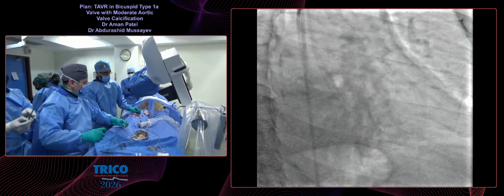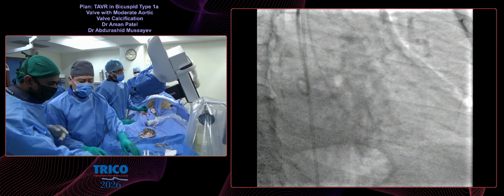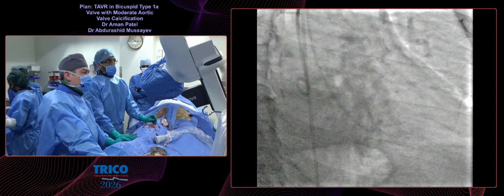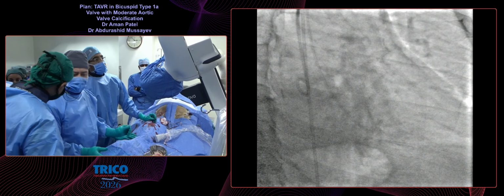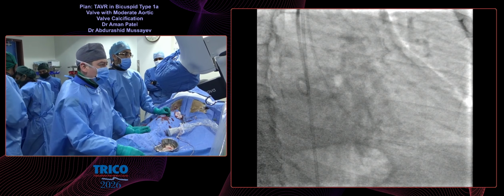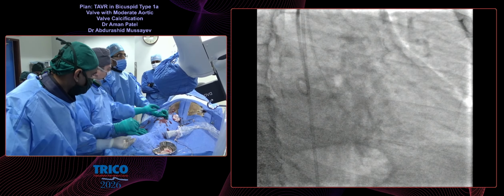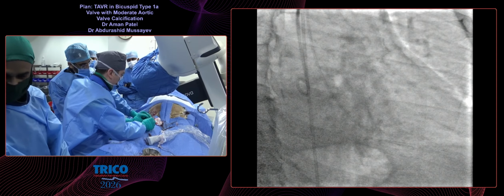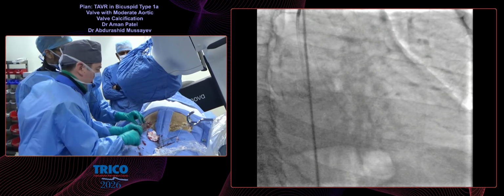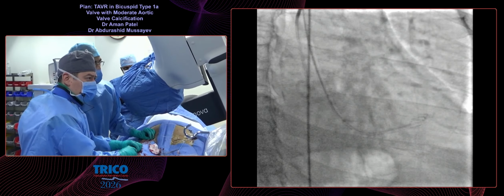Aman, can I ask you two questions just from a baseline? One is the 12-lead ECG, the conduction at baseline. You didn't tell us, is that normal? Yes, sir. The baseline 12-lead ECG does not show any conduction system problem. There is no bundle branch block, and PR interval is normal. But if we look at the valve anatomy, there are two risk factors for a pacemaker in this patient. One is the RL fusion, so the valve is going to pressurize on the non-coronary side, which is very near to the His bundle. And secondly, the membranous septum is short.